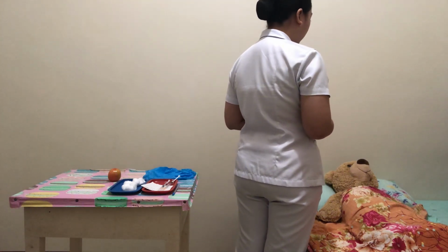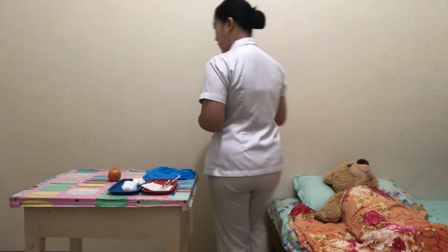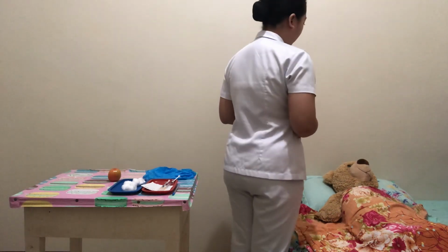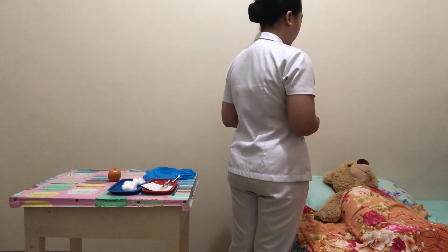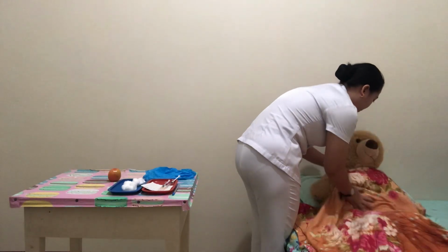Okay, ma'am, I'll be closing the door for your privacy. And also, I have already prepared your medication earlier. Closing the door will ensure the patient's privacy, and after doing that, we'll have to assist the patient in a comfortable position and then select the site for injection. Ma'am, can we sit?